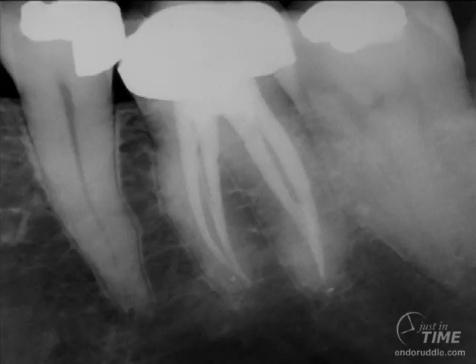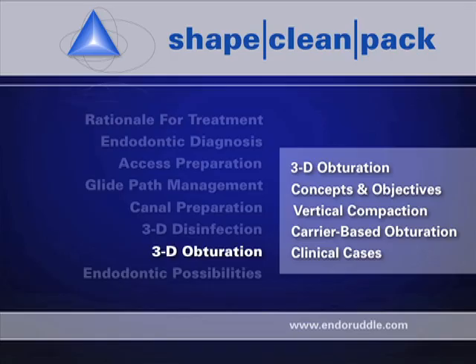The postoperative film shows the provisionalized crown. The shapes are smooth and flowing — gutta percha has been molded right into the apical thirds. Notice the webbing between the merging systems in the distal, the long anastomosing in the mesial system, and the deep apical bifidity. That concludes the clinical demonstration of vertical condensation of warm gutta percha.